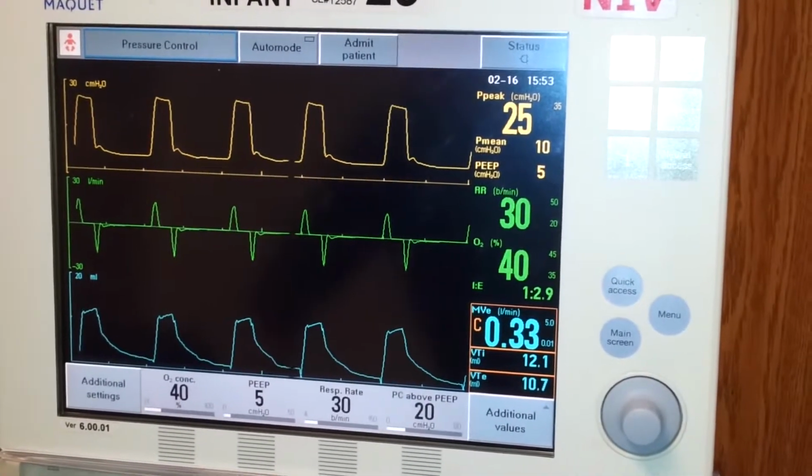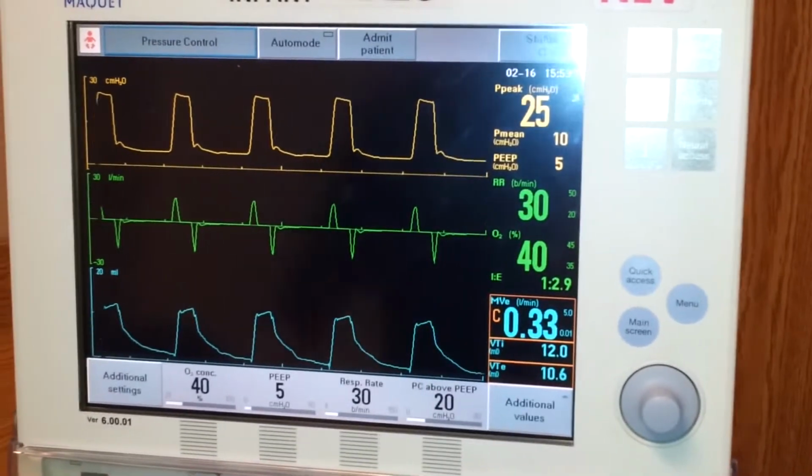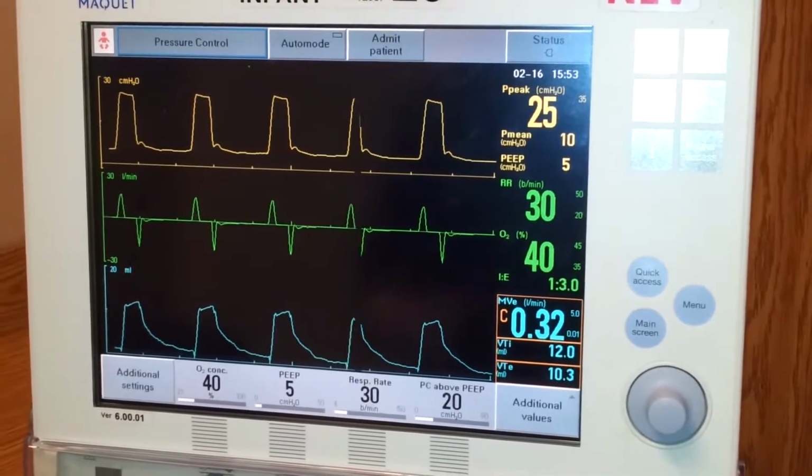Before we actually get into mechanical ventilation, we're going to review tubing compensation. You'll be expected to review the basics and what will happen when you turn tubing compensation on and off in a few different modes with the instructors.